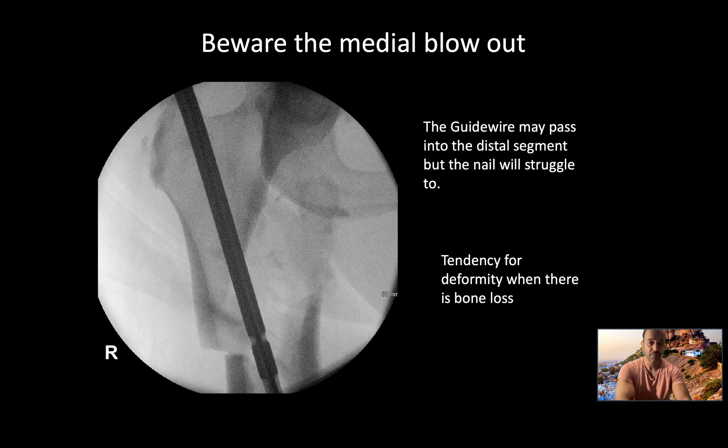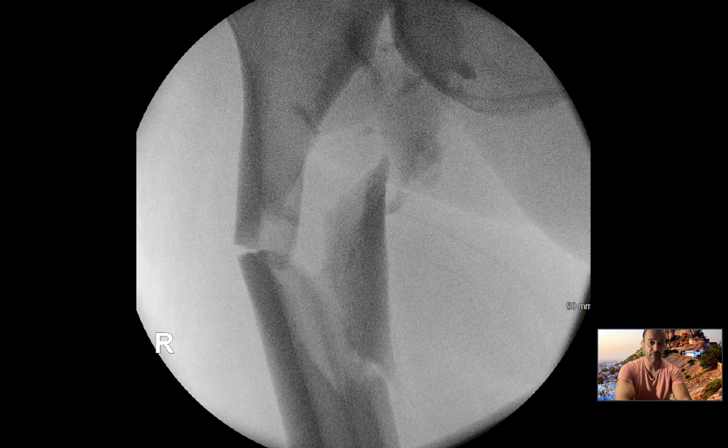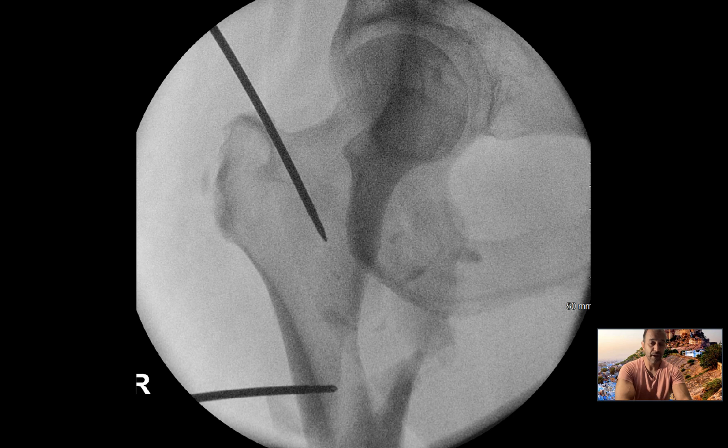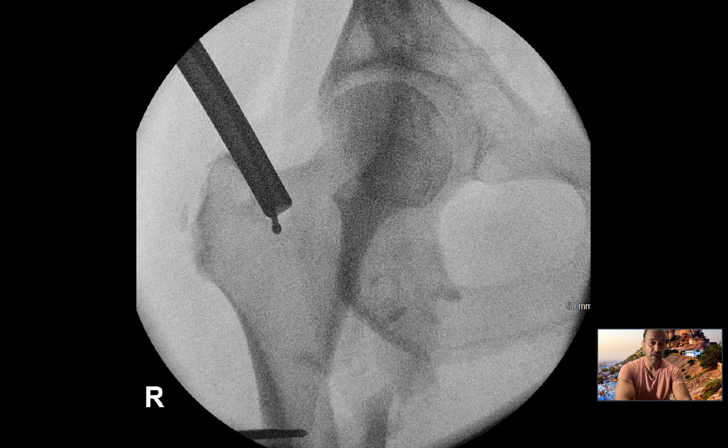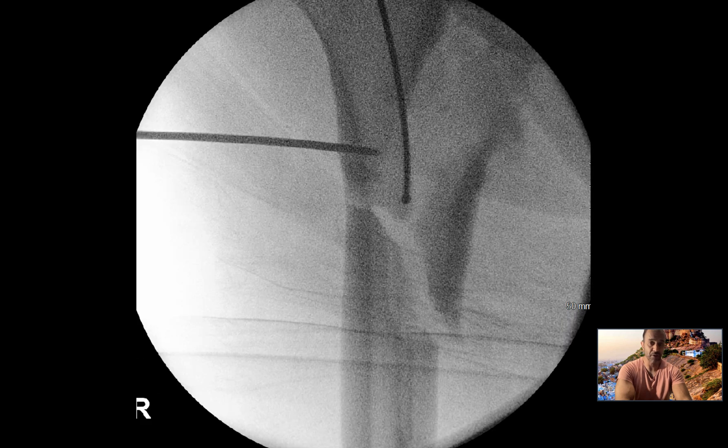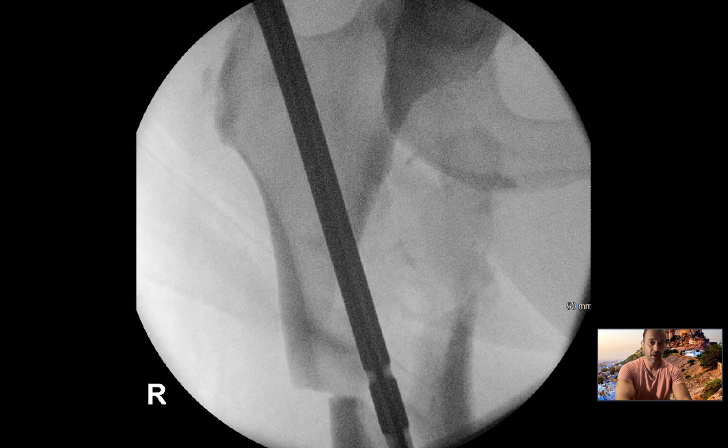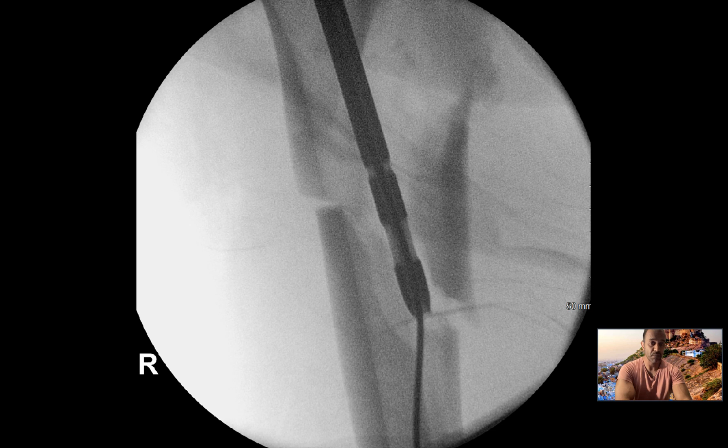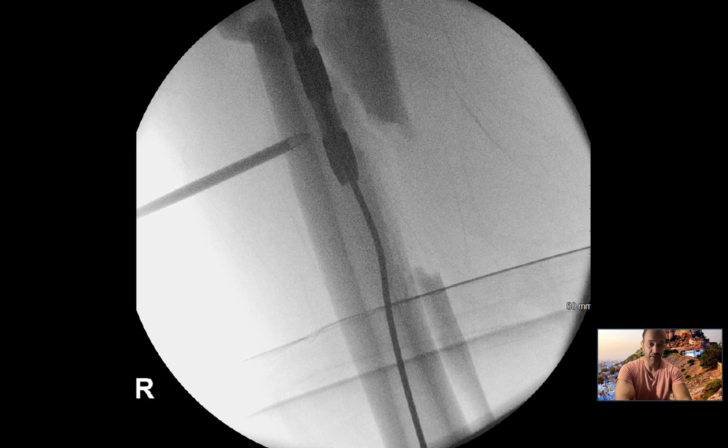Beware the medial blowout. The nail may bind onto it in a freehand technique. Here we've got a medial, post remedial blowout. The guide wire has gone down for the entry guide wire. This is an exchange tube, so on a nailing set there is a distal locking trocar and sleeve, and I can put that through my tiny little percutaneous hole to help swap out the entry guide wire for the ball-nosed guide wire. The curve in the ball-nosed guide wire helps it go down the correct channel. But the nail sometimes wants to go out where the blowout is, and therefore you just have to move the femur to the nail rather than try anything else.